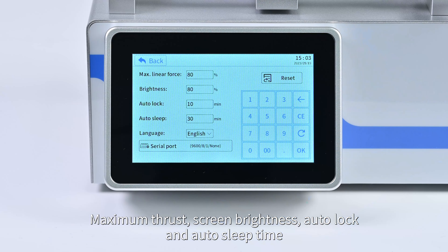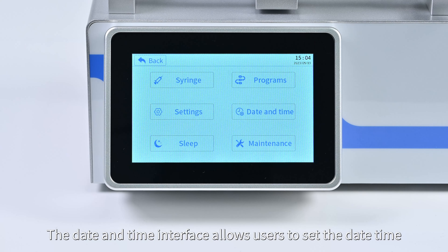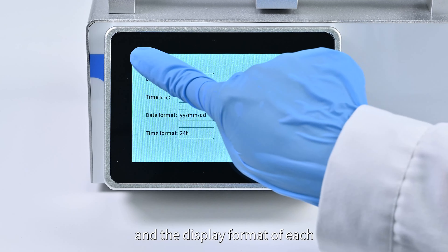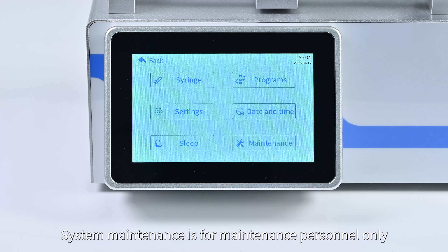In system settings, users can configure maximum thrust, screen brightness, auto-lock and auto-sleep time, and system language. The date and time interface allows users to set the date, time, and display format. System maintenance is for maintenance personnel only.